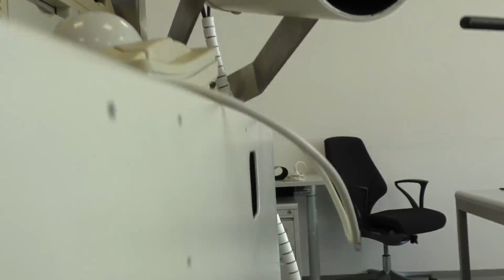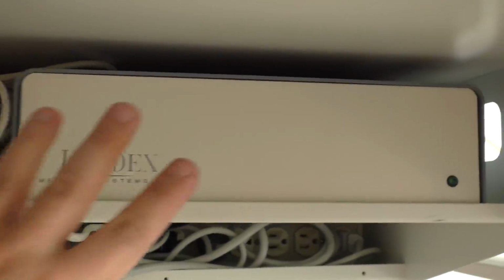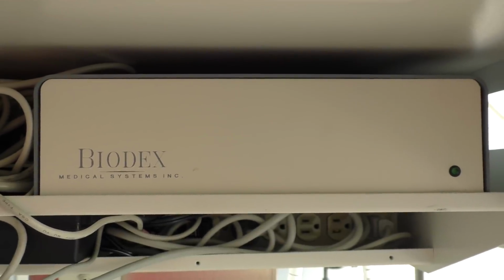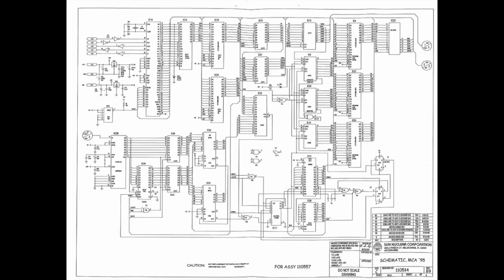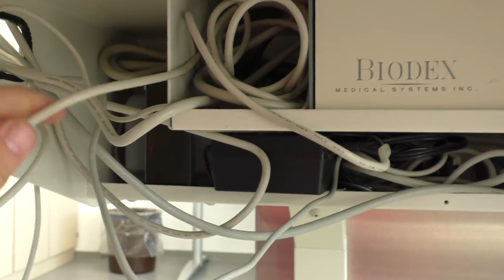And this box here checks and measures everything. It's not a big box, just like that. It has a high voltage power supply inside. I think the amplifier tube runs on about 1 kilovolt, something like that. And there is an analog-to-digital converter, and a counter that counts all the impulses, the strengths and the intensity. And there is then a serial interface that goes up to the Mac, and that's it.